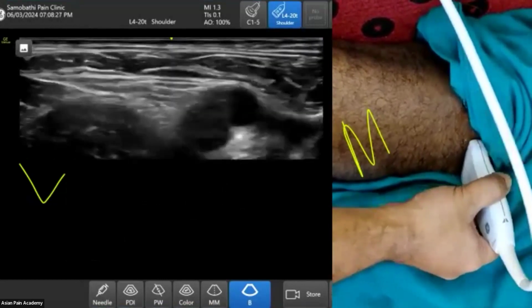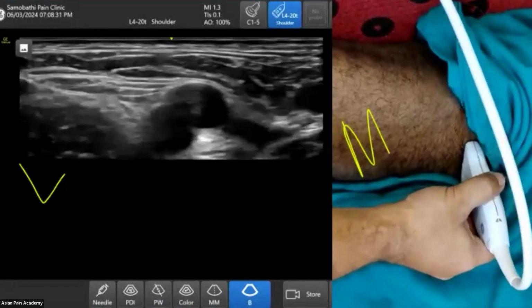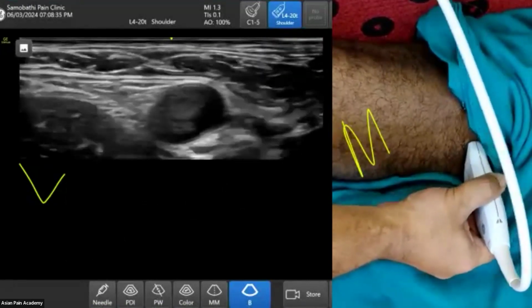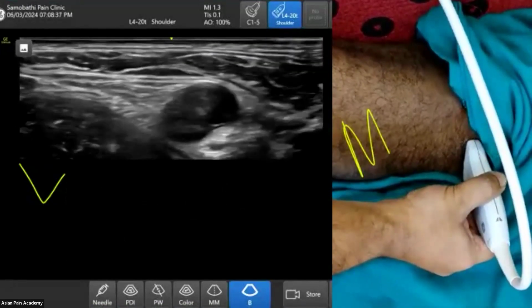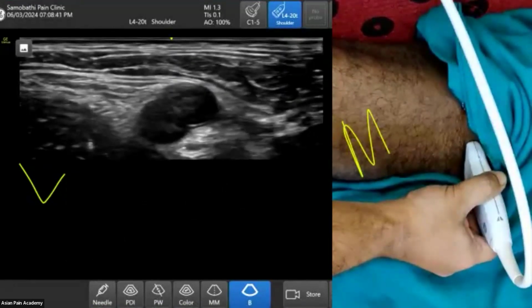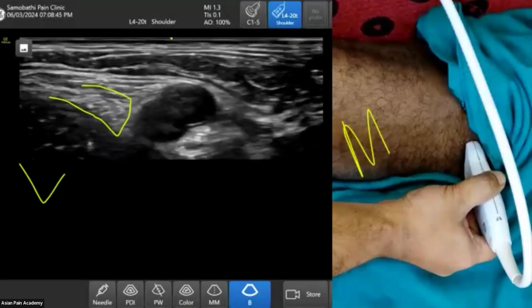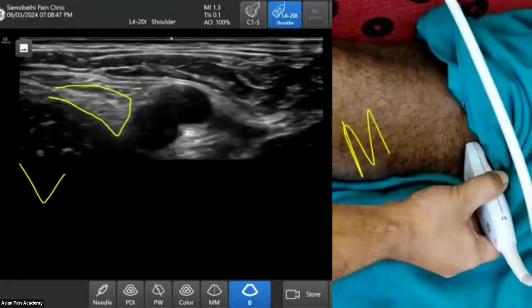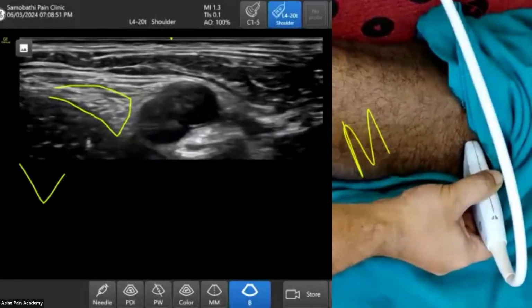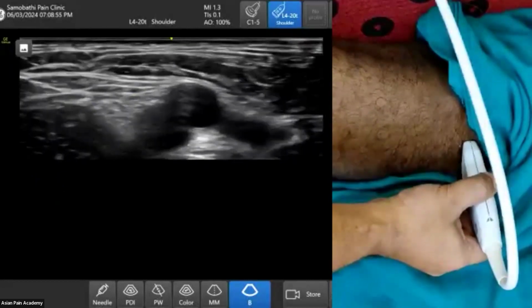This is common in this area. The nerve is flattened. This is vein, artery, and nerve. Yes, yes. So this is the nerve. This is the flattened nerve. This is at the margin of the iliacus. Margin of the iliacus. Here, see, artery.